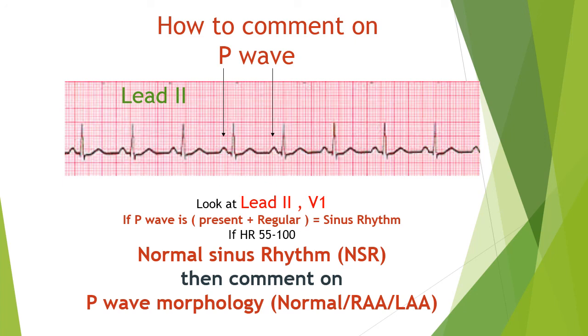And I hope this lecture gave you some information on how to comment on the P wave in the ECG, and I hope it helps you, inshallah, in the future.